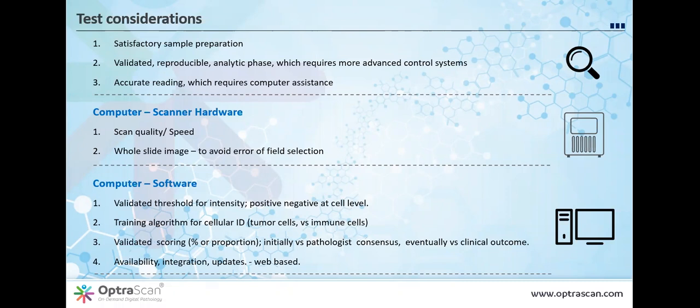And then item 2 is the actual assay we perform. The IHC stain, in parentheses, is really no longer a stain under these circumstances. It's actually an attempt to be an assay, because we're going to try to quantify it. A stain, we just stain it, and it might be intense or light, but we don't quantify it. An assay, we try to quantify it. So this is stretching immunohistochemistry to a new level of performance. We have to validate it.